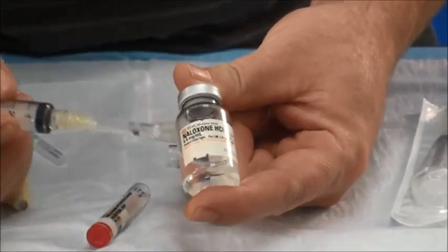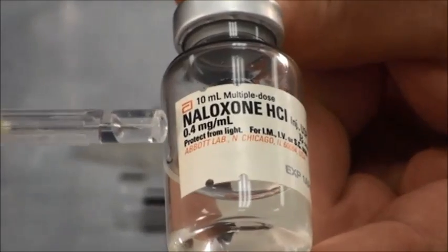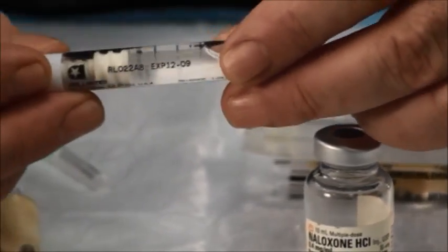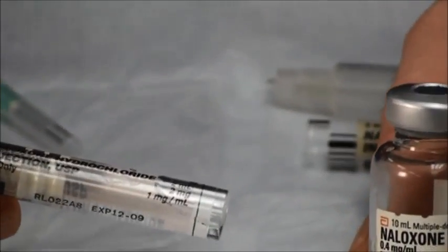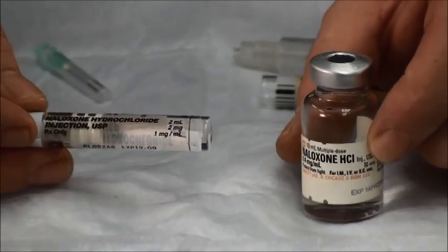This is a multi-use vial. In this particular vial there is 0.4 milligrams per milliliter. In this pre-filled syringe there is one milligram per milliliter. So the dose and volume are a little bit different from each, so you have to be completely aware of what you're using at your system.